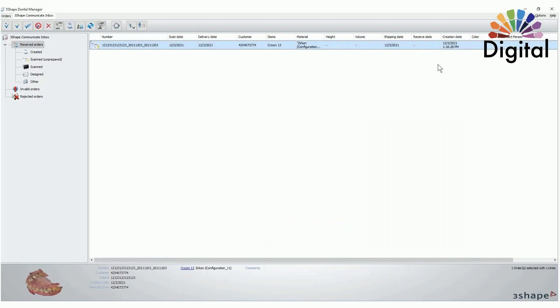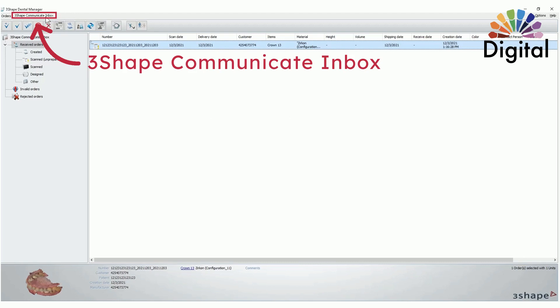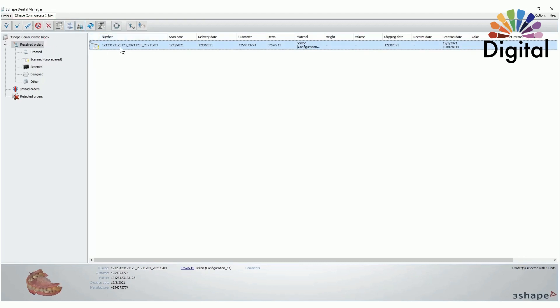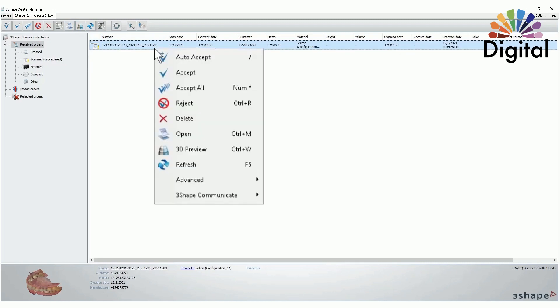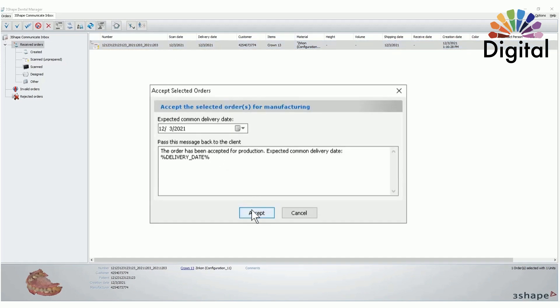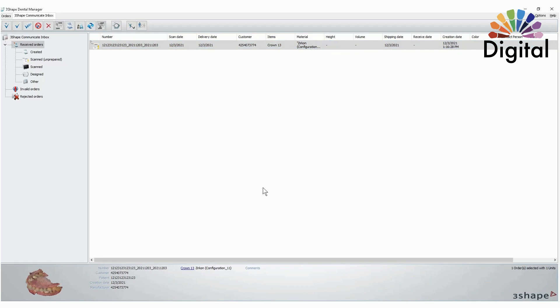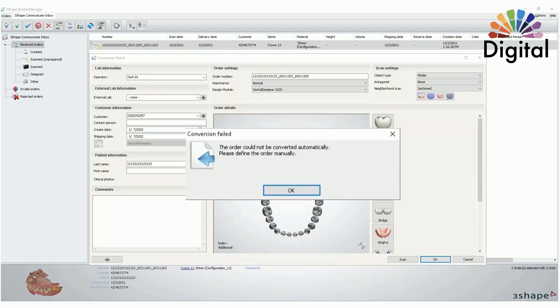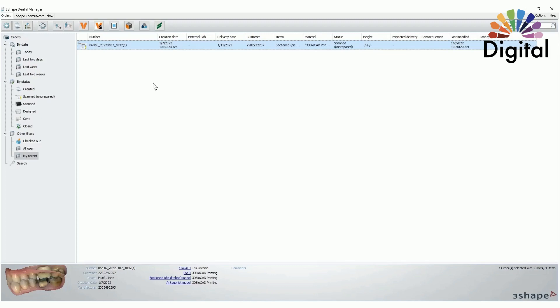Once you send your Trios scan file to your dental system, the scan file will always come into the Three Shape Communicate inbox first. What we need to do is just right-click and accept. Once we accept the file, you can just hit OK and the file will transfer into your orders. Now the case file is in the orders, not in the Three Shape Communicate inbox anymore.